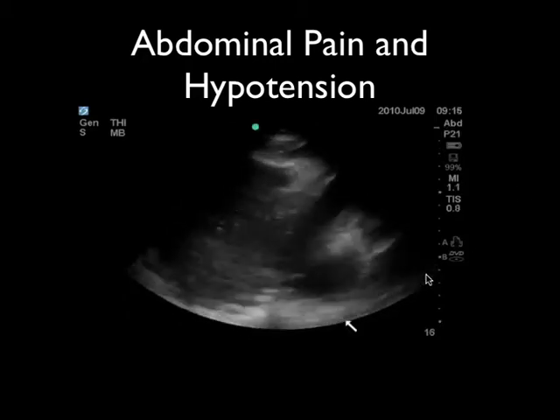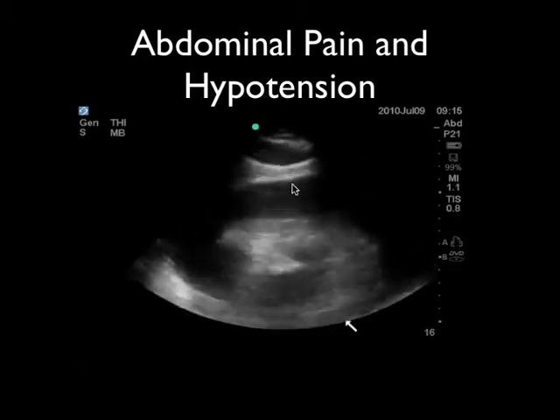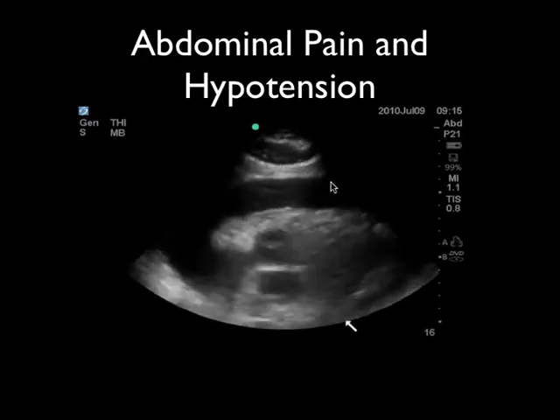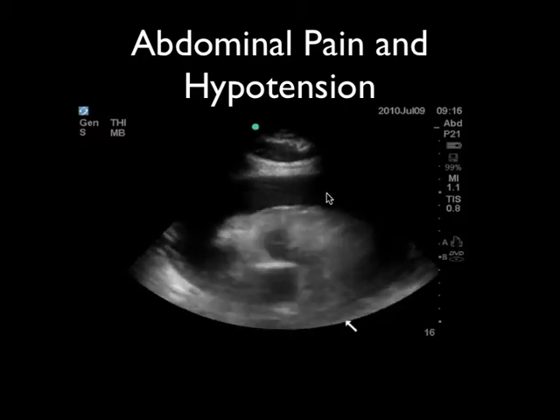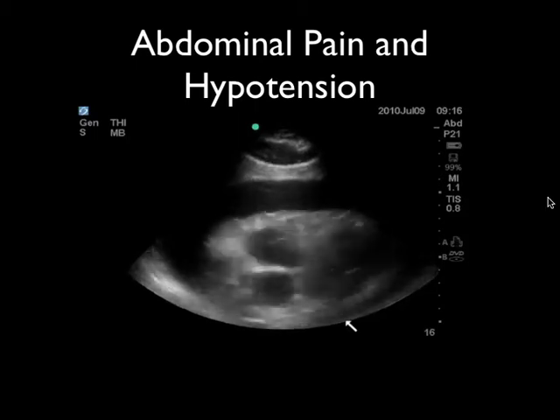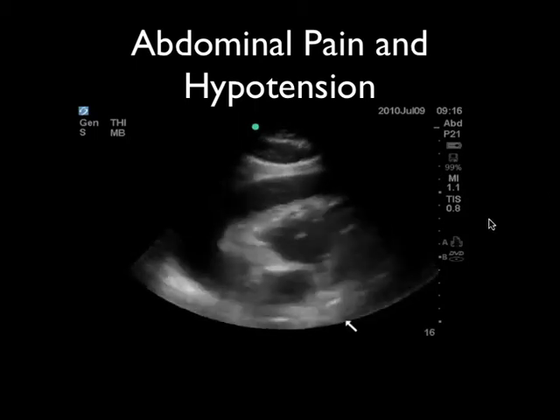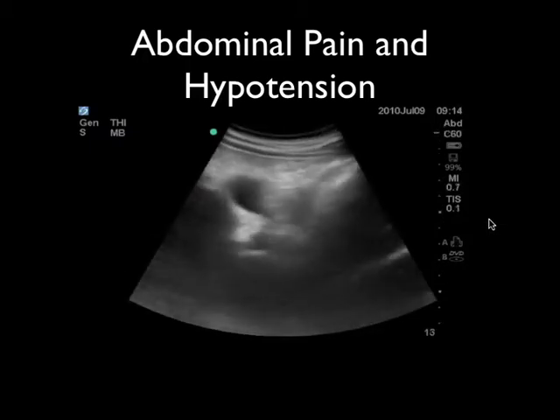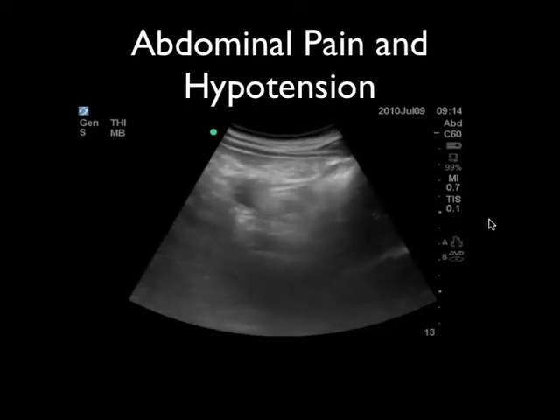Yeah, down here in the corner there's this pericardial effusion, and actually this patient's got a pretty significant pericardial effusion, and it's hard to tell from this particular view whether there's really tamponade physiology going on here. But in the setting of a patient with at least a 2 centimeter pericardial stripe here who's hypotensive, and when we got a little bit better history, when we controlled his symptoms, maybe he was a little bit more short of breath than he had abdominal pain.